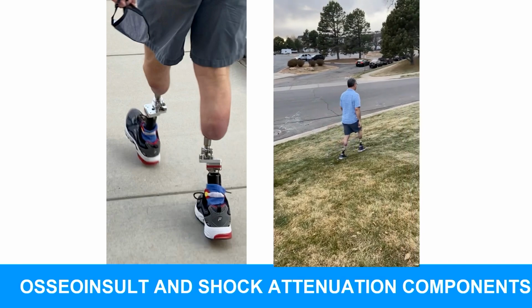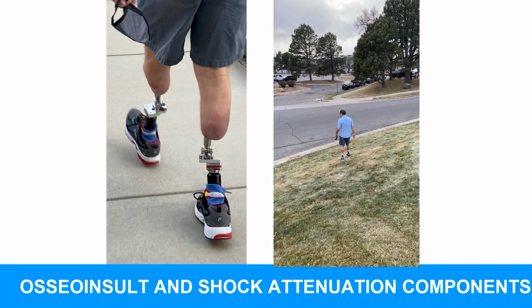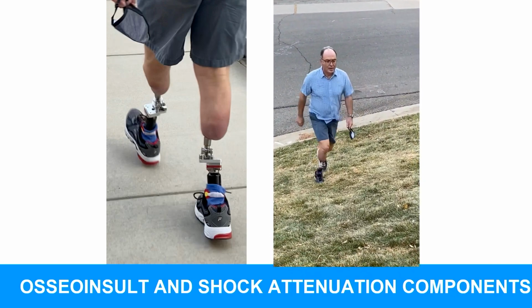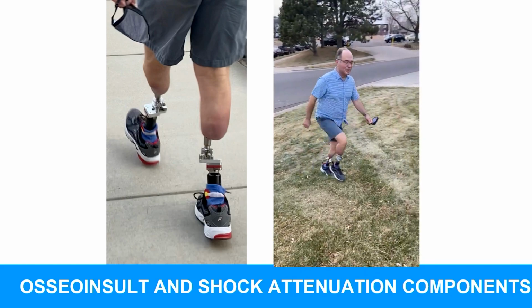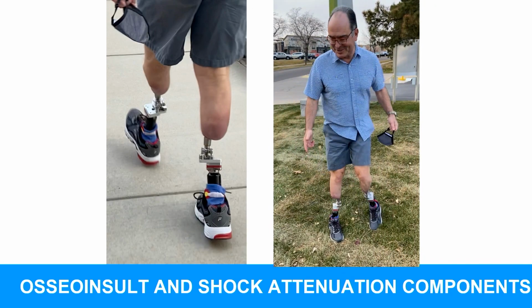This is Jeff, December, I can't believe I remember this date, December 9th last year. He came to me saying, "My step count's going down and I'm having some distal tibia pain on my left side." And I was having such good luck with hydraulic ankles and vertical shock systems. We put him on an Echelon VT, and he could probably tell you better than I am, but his step counts significantly went up. He did it in a controlled manner, but over the next 2 to 3 months, his step counts went up to? Double. Average 6,000 a day, with peaks of 10, 12. And that was the first time, literally the first 10 minutes on that foot.